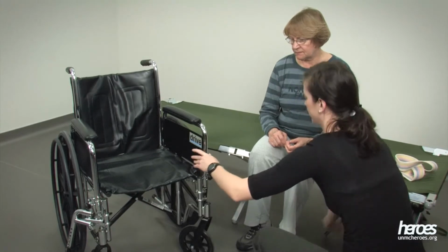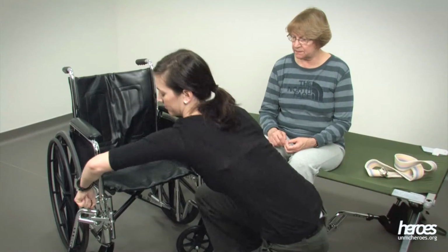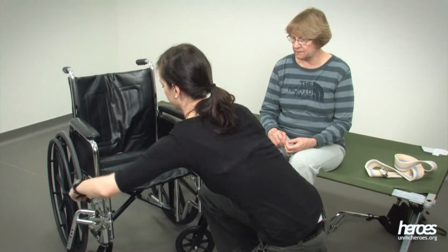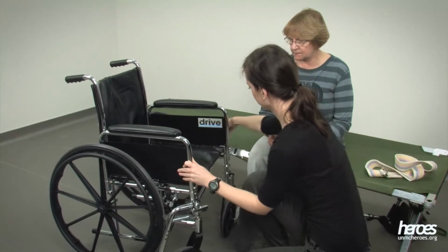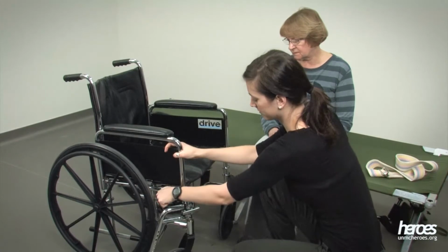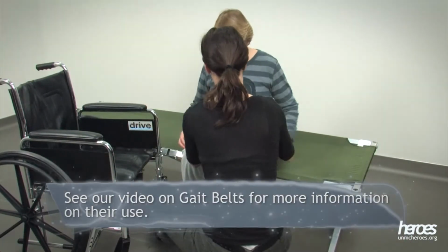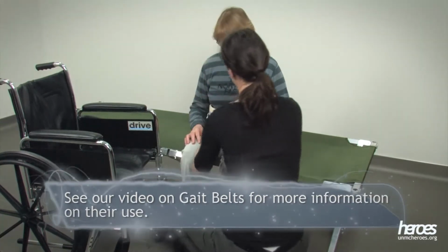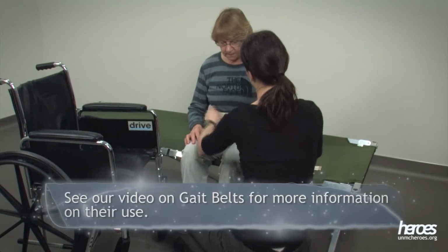After removing the leg rest closest to the cot, unlock the brakes on both sides and reposition the wheelchair so that it is closer to the cot and still at a slight angle to it. After locking the brakes, fasten a gait belt around the individual's waist for safety. Thread the head of the belt through the teeth of the buckle first, then through the other end. Make sure the belt is nice and snug.